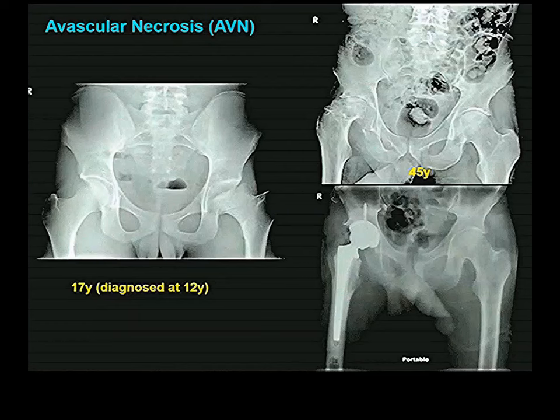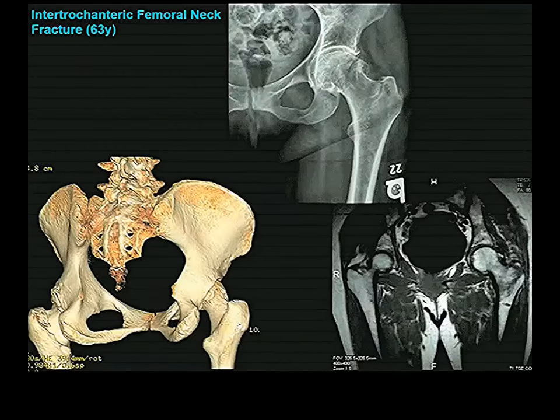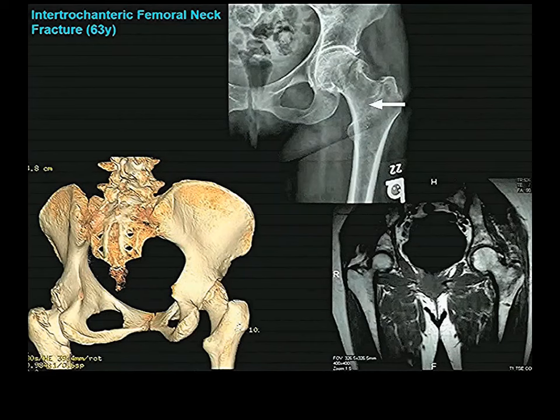In this case, they also replace the acetabulum as well.